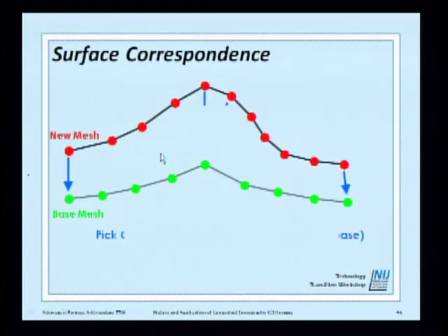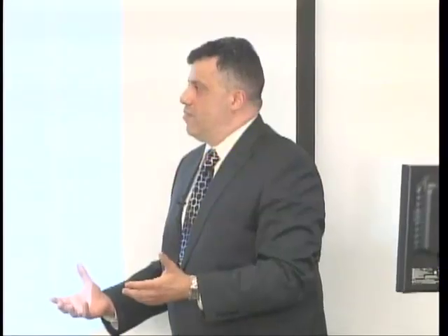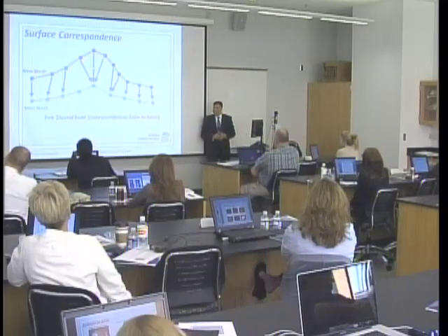So basically what happens here is you have the new bone coming because someone did it. It may come from a different source, not your lab, another lab. Someone segmented the bone, and the skull has thousands of different points, while your base template may not have the same number of points. So usually when we put them together to register, you will have a number of vertices competing on the same spot.